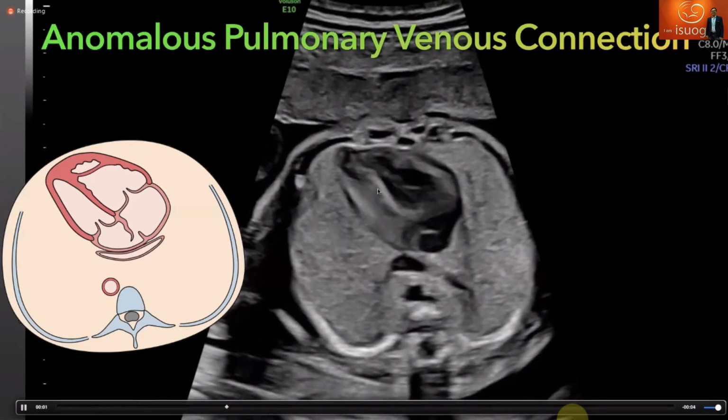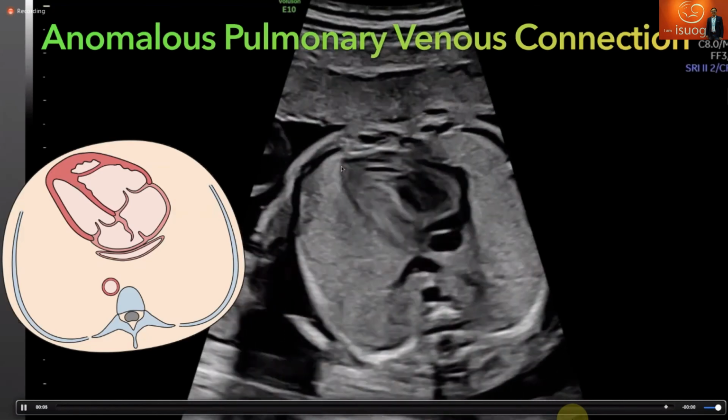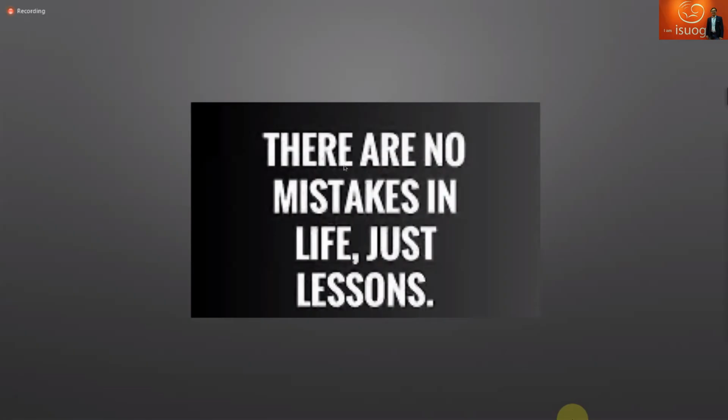Yeah, I know it's not nice from me, but you know, this is life. This is why in life there are no mistakes, there are only lessons. I hope every case you miss, it should be the case you say, I will try next time not to miss it. Don't be upset.